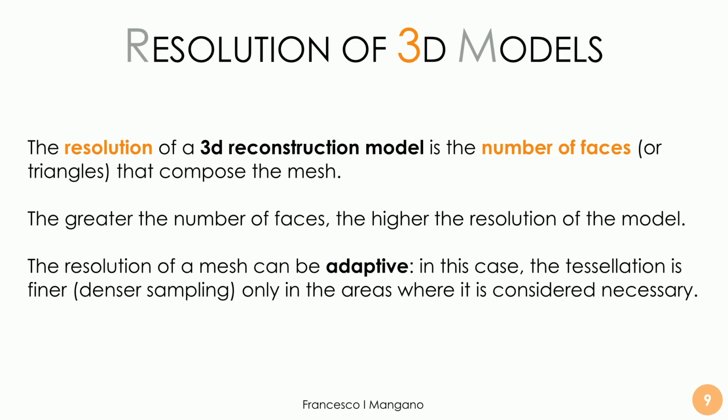So, the resolution of 3D models. What is the resolution of a 3D model? The resolution of a 3D reconstructed model is the number of faces, of triangles, that compose the mesh. So we have a resolution of acquisition given by the different cameras that the intraoral scanner has, and usually intraoral scanners are equipped with very powerful cameras.